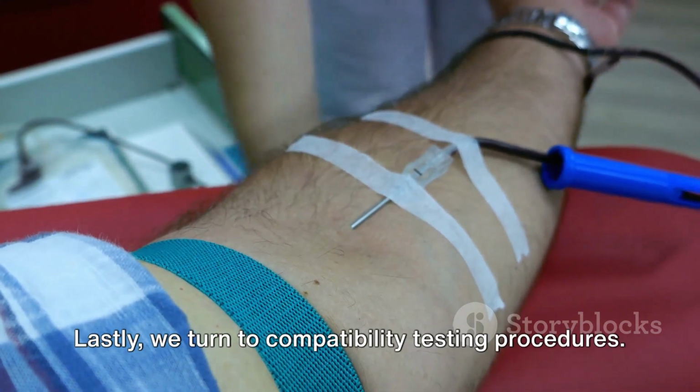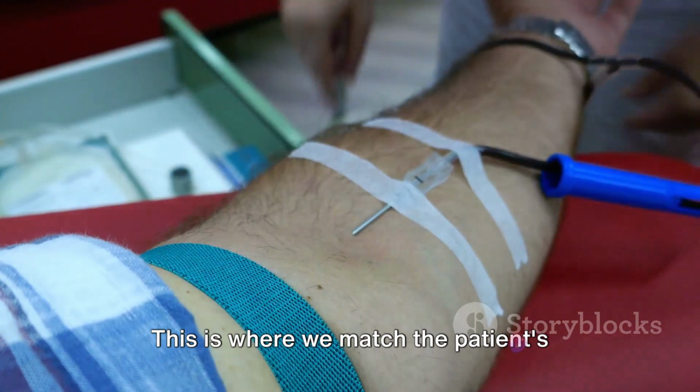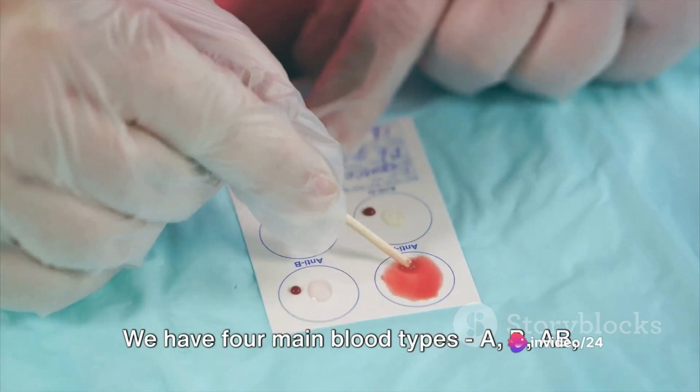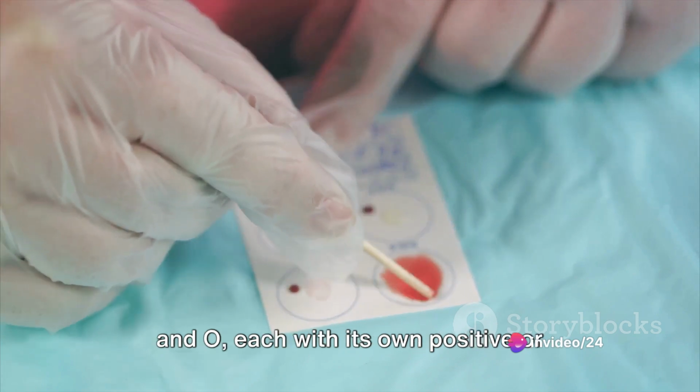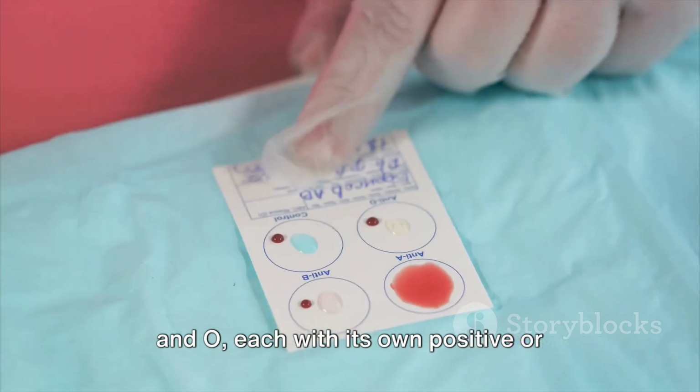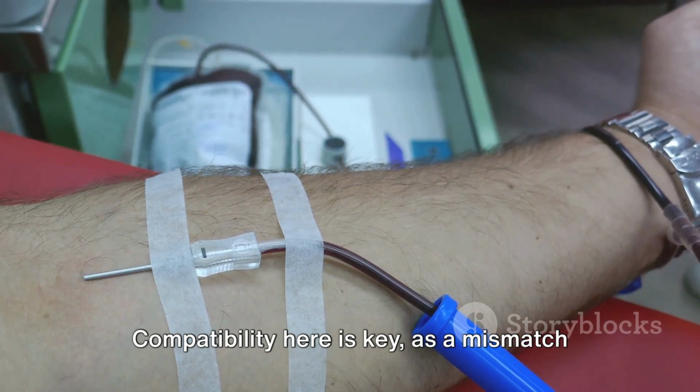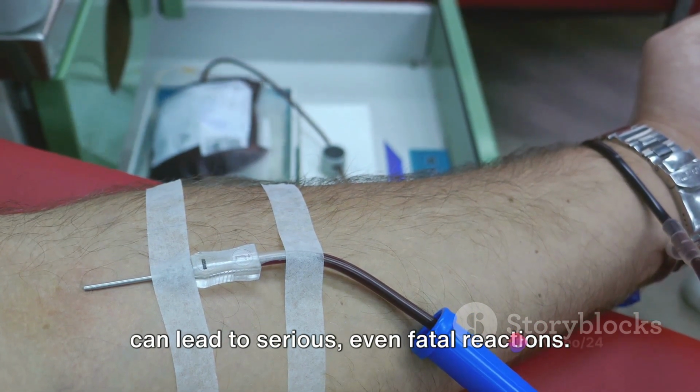Lastly, we turn to compatibility testing procedures. This is where we match the patient's blood type with the donor's. We have 4 main blood types, A, B, AB, and O, each with its own positive or negative Rh factor. Compatibility here is key, as a mismatch can lead to serious, even fatal reactions.